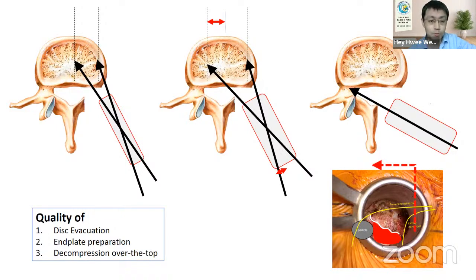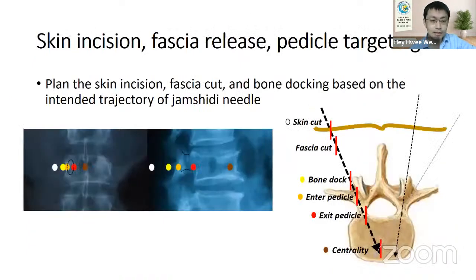If you want to do ipsilateral removal of the lamina, orient yourself again and do an L-cut as shown here. The next thing will be the pedicle screw insertion. Some people like to do the pedicle screw insertion first, placing the wires and keeping them out of the way before doing the TLIF. I tend to do the fusion first with a larger incision, followed by pedicle screw insertion.